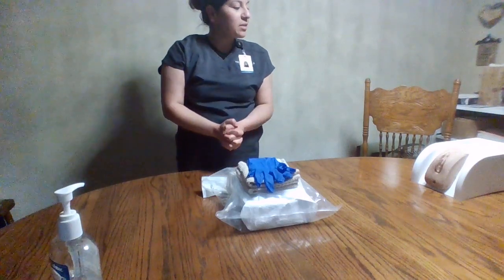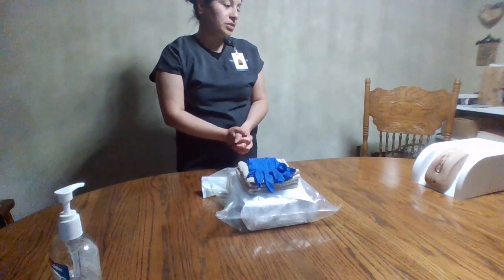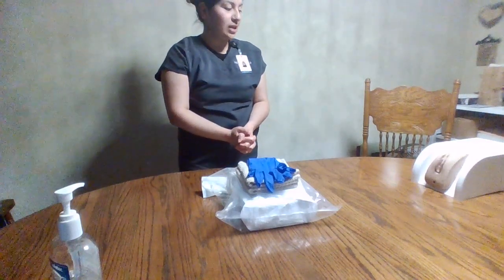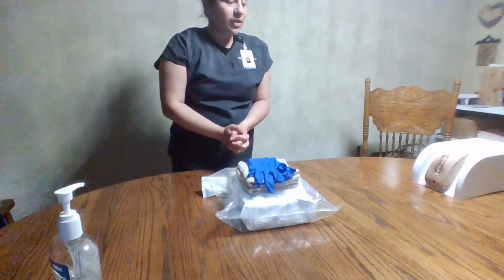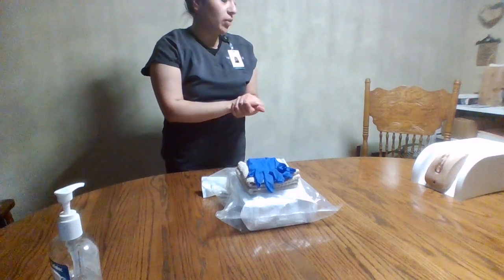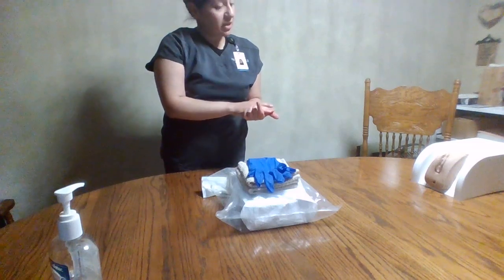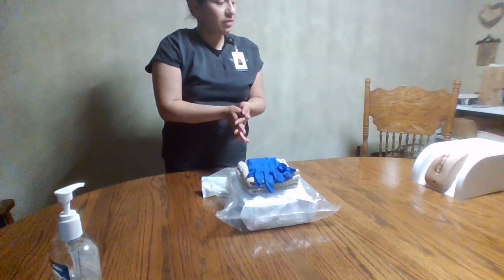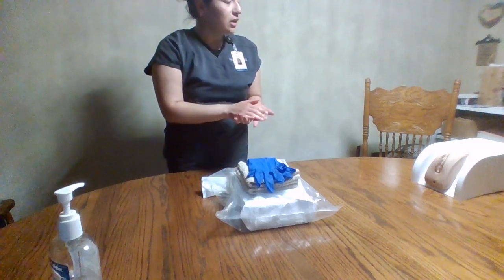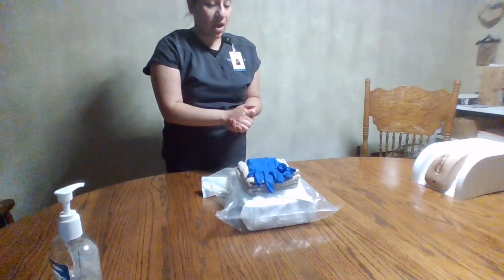Hi, Mrs. Smith. So it looks as though your doctor has placed an order for a Foley catheter today due to some urinary issues that you've been having recently. So I did want to go ahead and let you know about the procedure. I would begin by placing you in a lying flat position with your knees bent and pointed outward, and cleanse and inspect the area. I will then set up the Foley kit. Once that's been set up, we'll clean you once again, and then insert the Foley catheter.